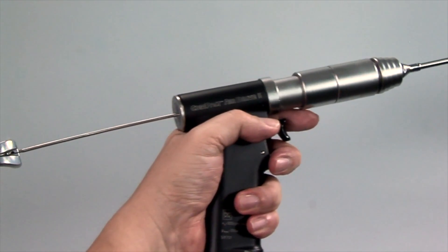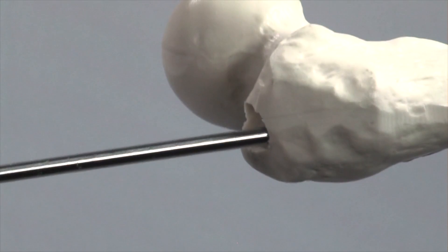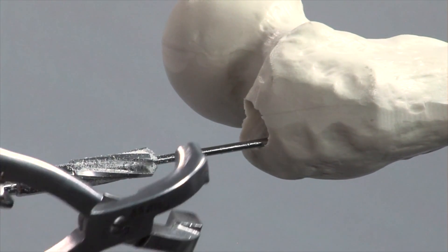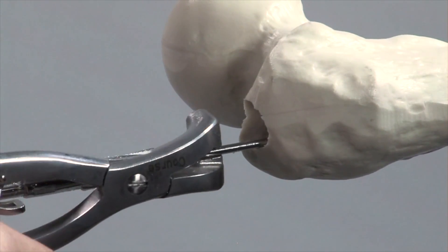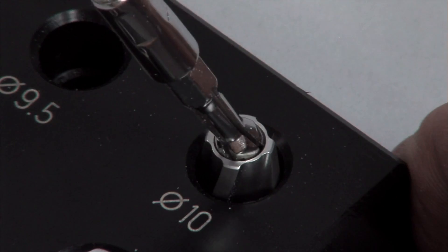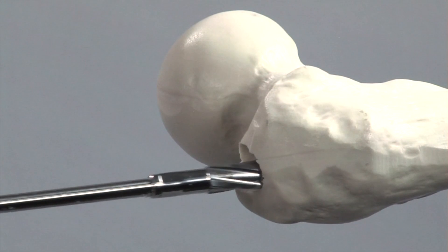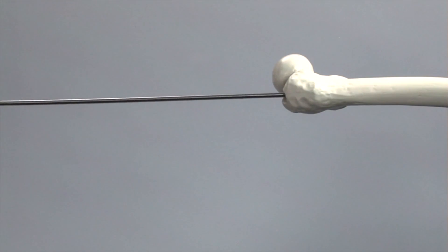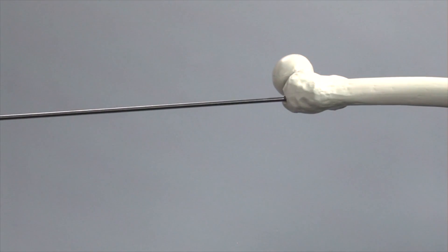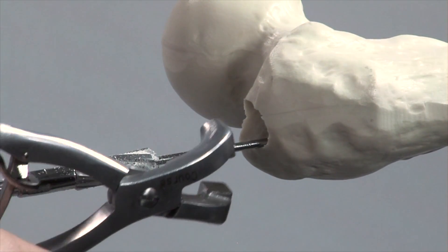The reamer is advanced with gentle back-and-forth movements. The holding forceps are used to hold the reaming rod in place while the reamer head is exchanged. The medullary canal is reamed up to a diameter of 10mm. Again, the holding forceps are used to hold the reaming rod in place.